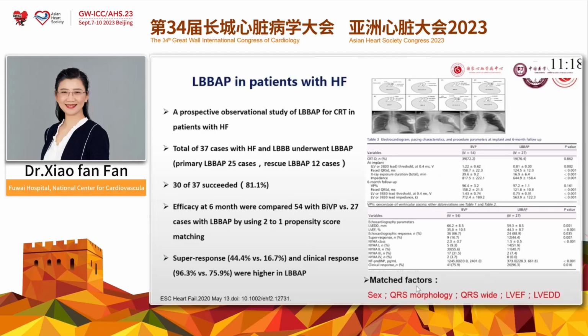Our team also studied the impact of LBBAP for patients with heart failure. This study was published in 2020. At that time, we just observed the impact of LBBAP, and we found the success rate was a little bit low. Now maybe the success rate will be higher in patients with heart failure. Patients with heart failure have an enlarged left ventricle, and the procedure might be challenging.